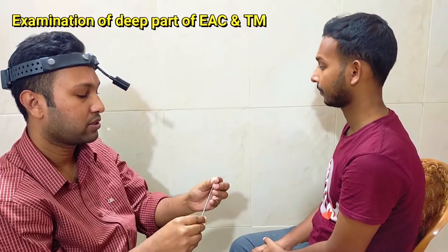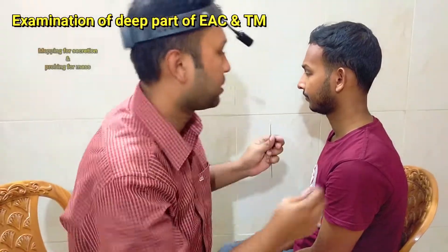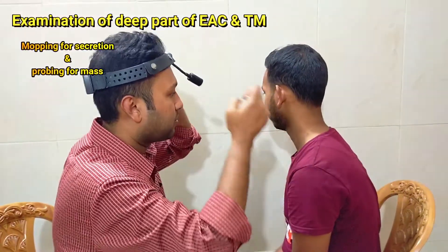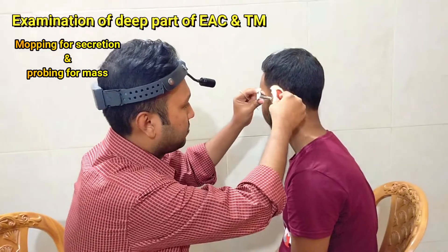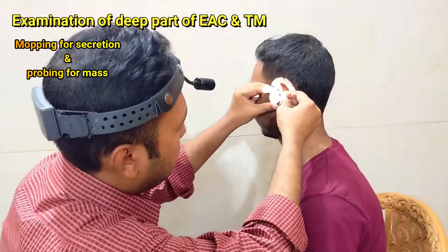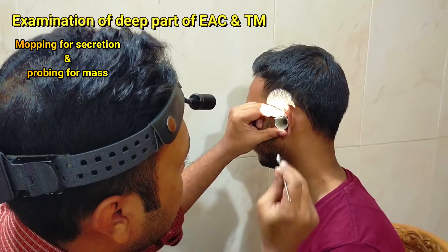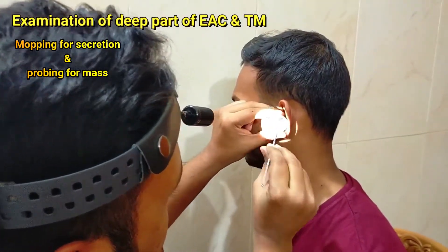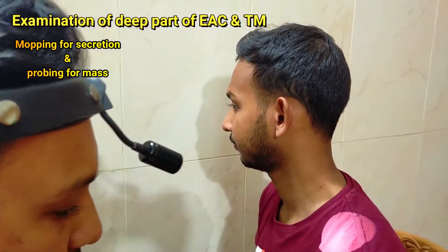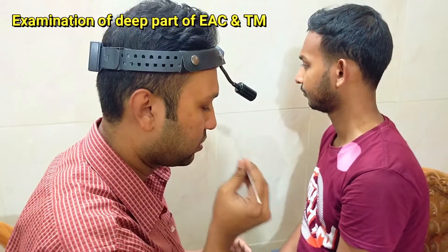We can mop the external auditory canal if there is any secretion. After mopping, the cotton bud is looked at for color of the secretion, thickness of the secretion, its amount, and smell.